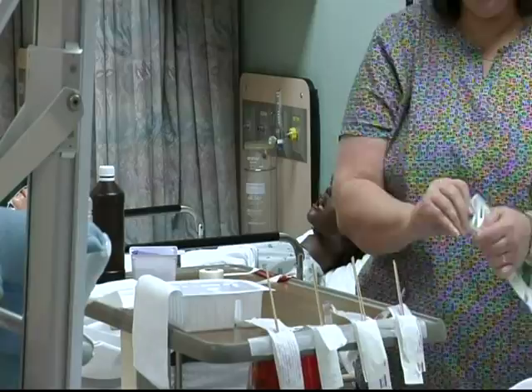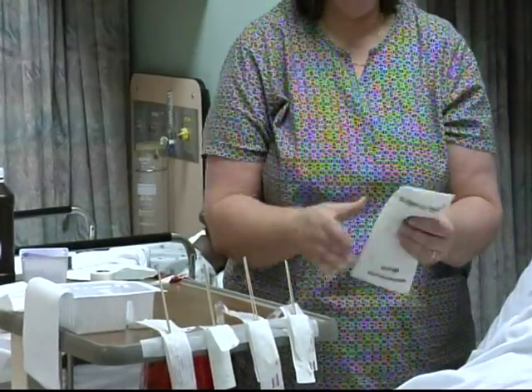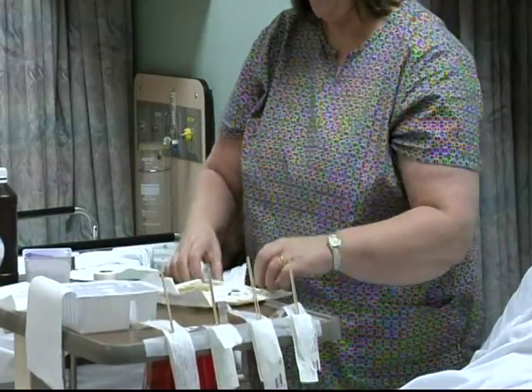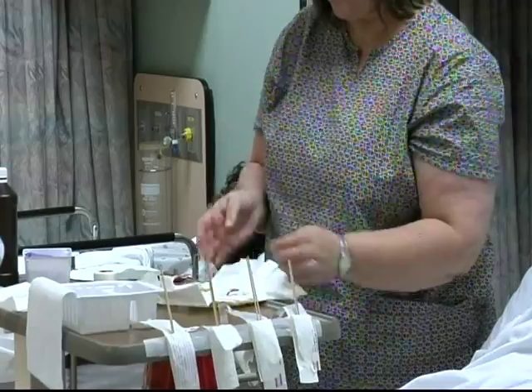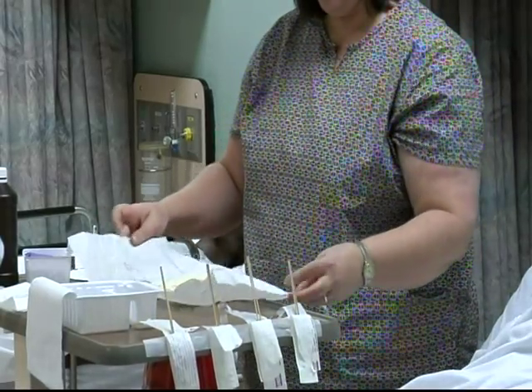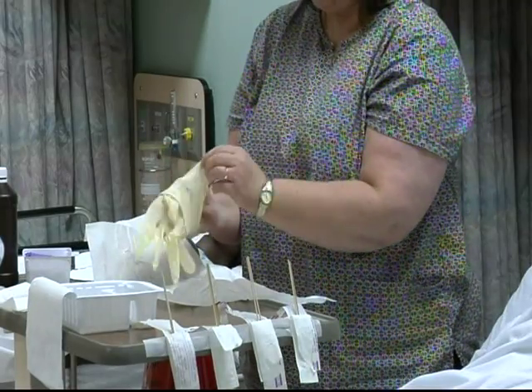Then you've got your sterile gloves. The package of your sterile gloves goes over your open supplies that you're going to be using. Apply your sterile gloves the way you were taught.